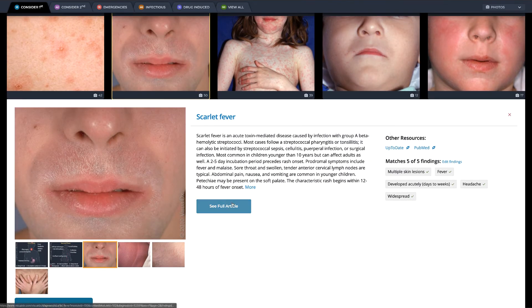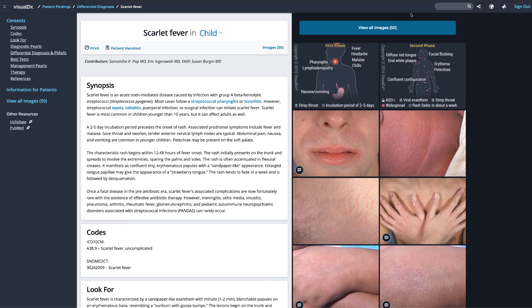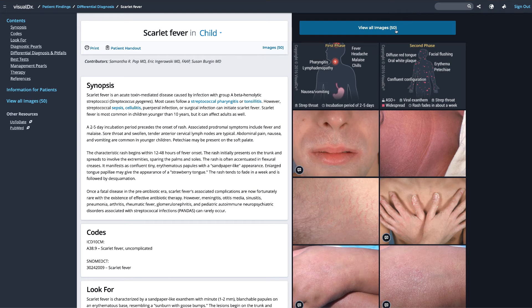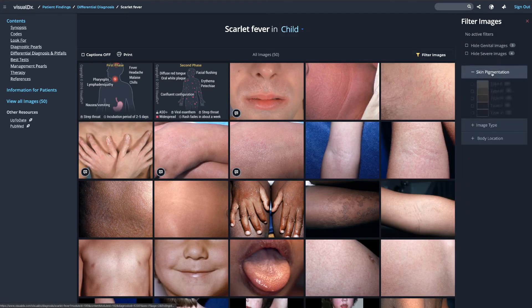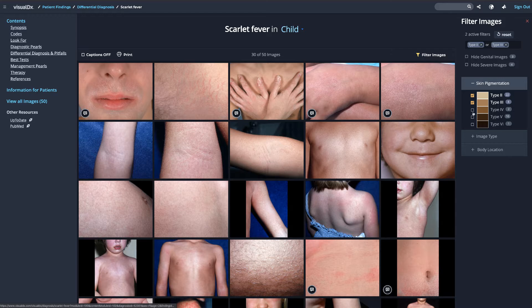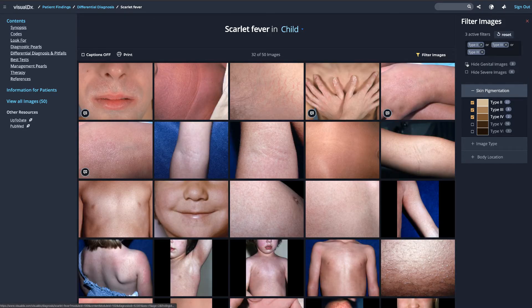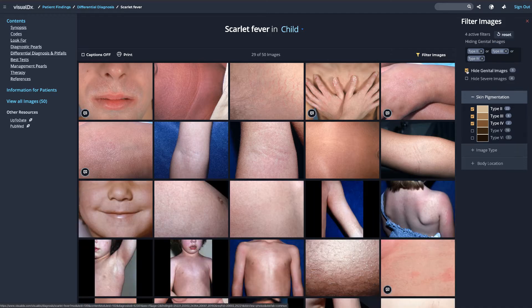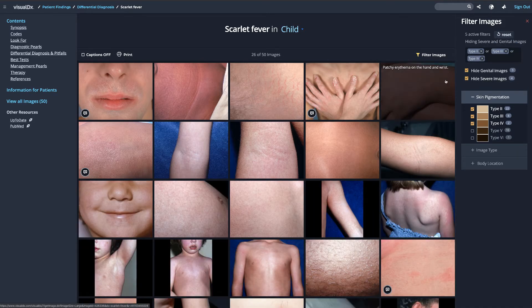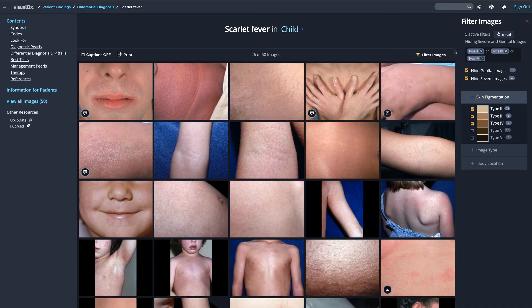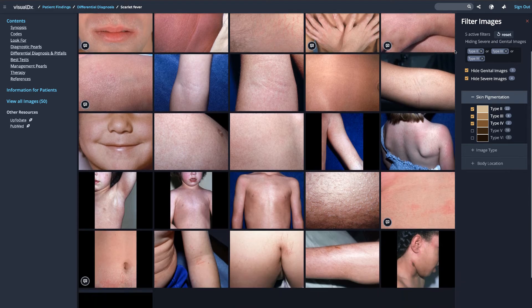Once you have made a diagnosis and read our concise expert text on the best treatment and management pearls, show your patient appropriate images as you video conference with them. Filter images to quickly narrow your search to find the image that best matches your patient's presentation. You can filter out severe and genital images with a check of a box before you show your patient.